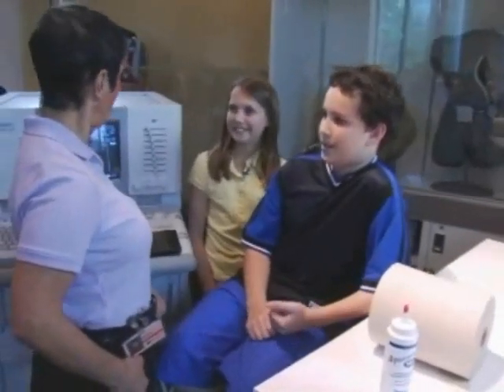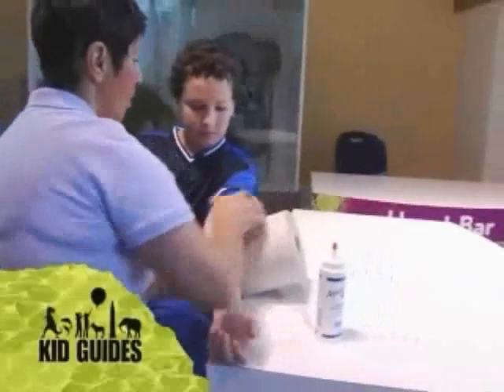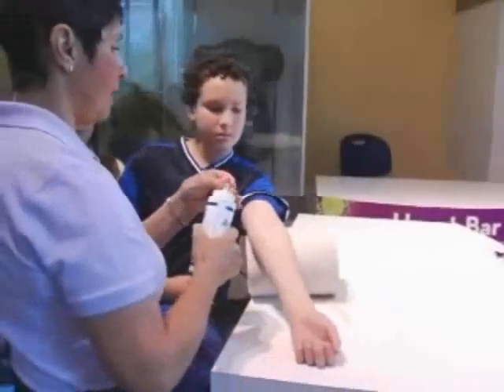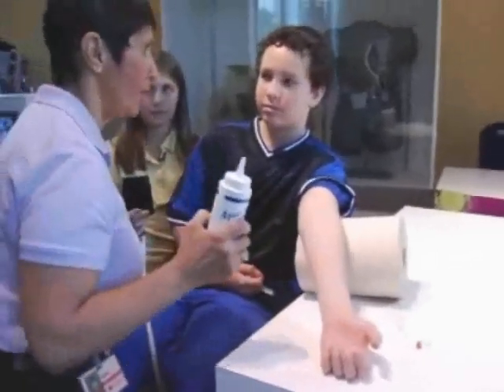No idea. It's called an ultrasound machine, and it looks at all your soft body parts. Matt, I'm going to have you put your arm right up like this, and we're going to look at this part of your arm here, your elbow. We might even be able to see his elbow joint. Now this is going to be cold and yucky, so it's going to be fun.